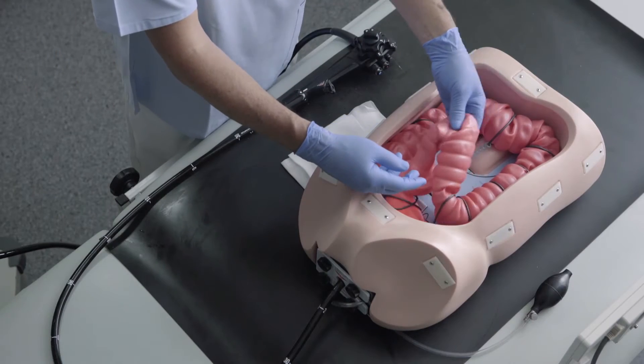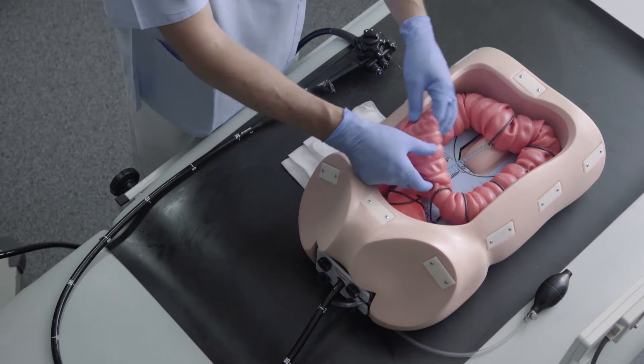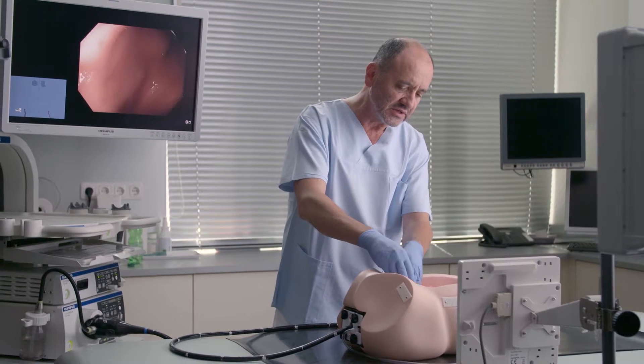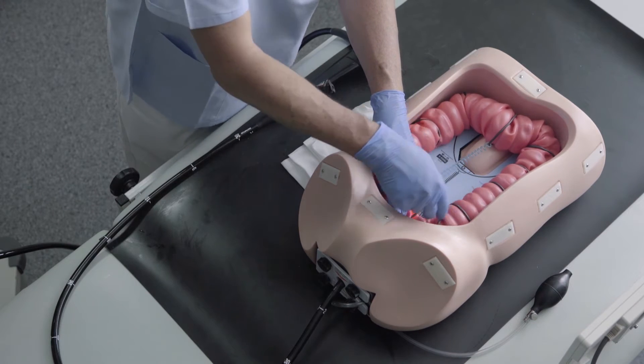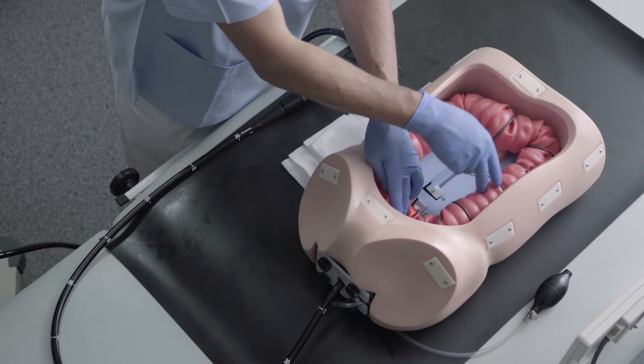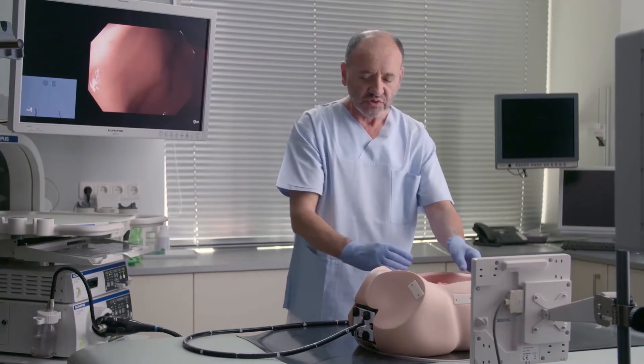This one is very flexible, and if you just push on it, it will cause a lot of pain to the patient. So the purpose is to have it as straight as possible to really pass the sigmoid-descending junction and get into the descending colon and farther up to the cecum.